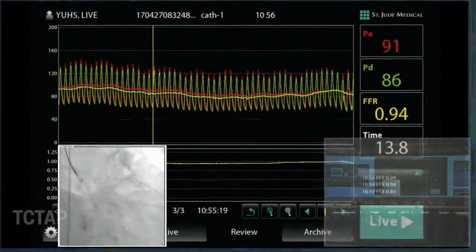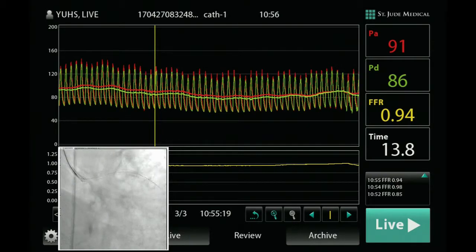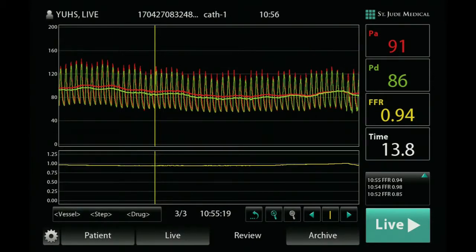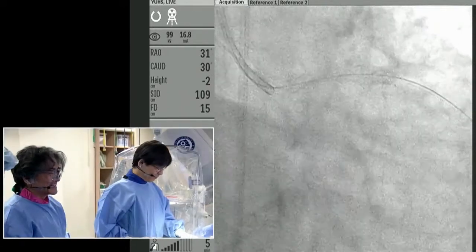As I said, no use of the contrast. Exactly, zero. We cannot enjoy the final result, but at least we need one injection, please. If any fellow is here, we need at least 2 projections. That is for very experienced operators.